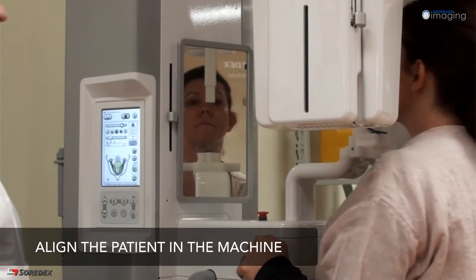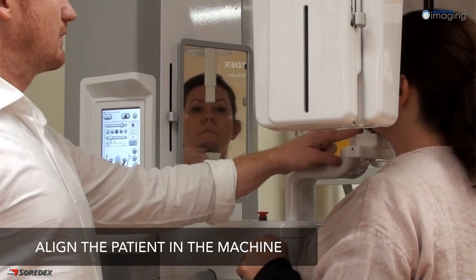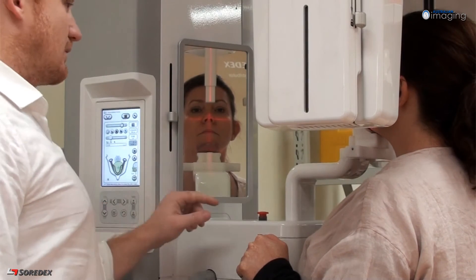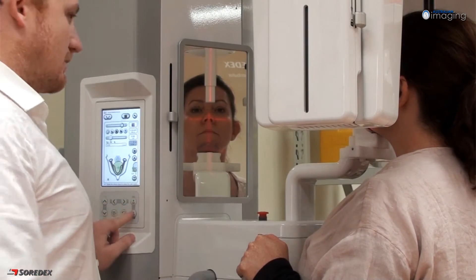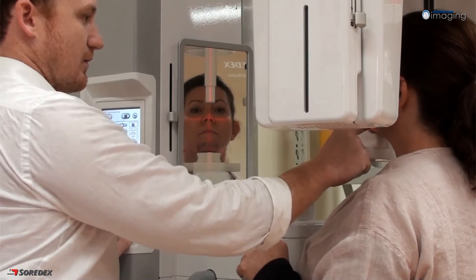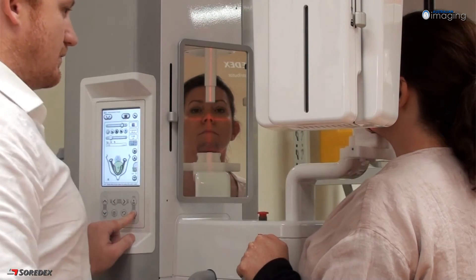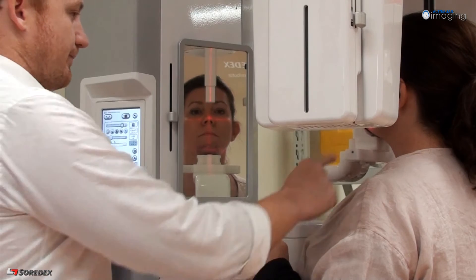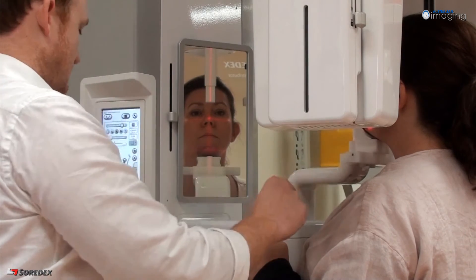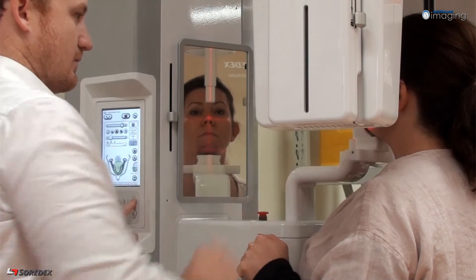Place the appropriate bite piece and chin holder into the unit. Using the manual controls, position the patient so that the horizontal field of view lasers are aligned to your region of interest. Next, check the centrality of the beam by ensuring the mid-sagittal light aligns with the mid-sagittal plane of the patient.